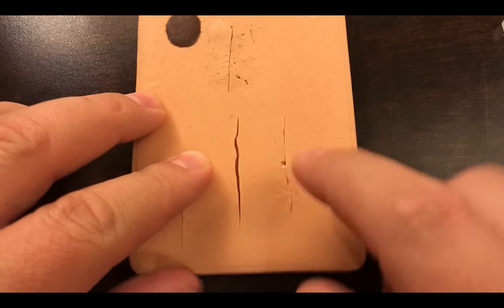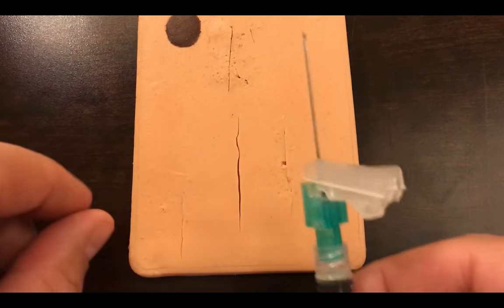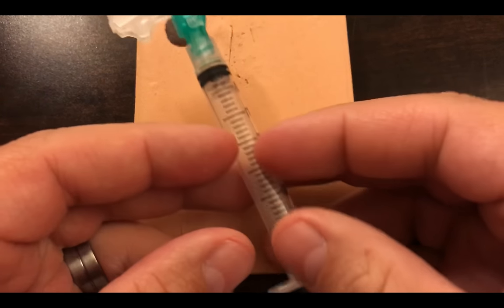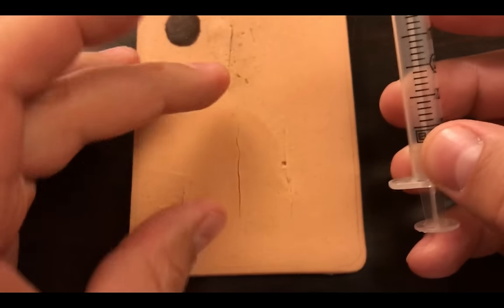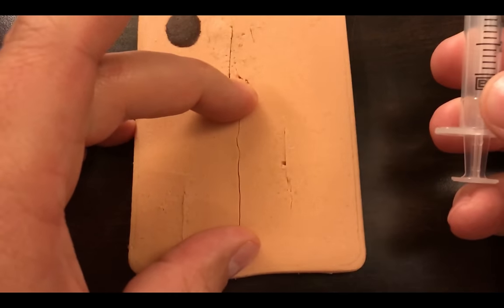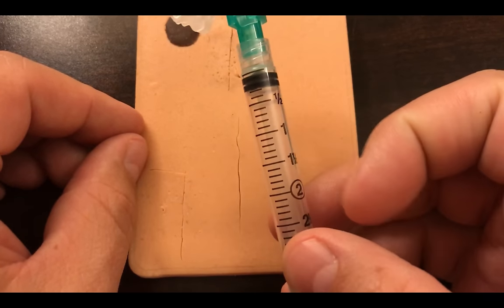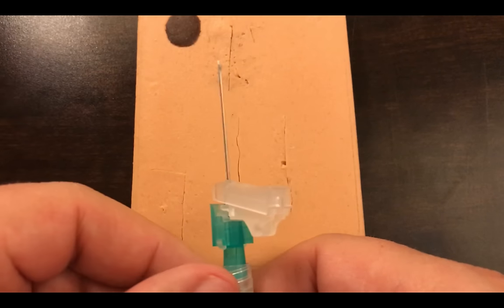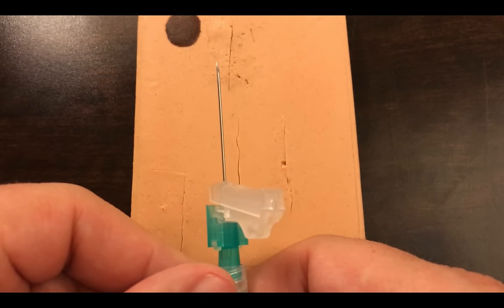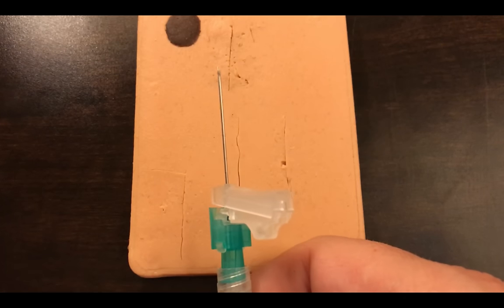For this video I'm going to use this middle laceration here to demonstrate, using this needle. This syringe is only a 3cc syringe — normally I'd use something like a 6cc and draw up maybe 5cc of lidocaine depending on the length of the laceration. The needle you generally want to use is something like a 25, 27, or 30 gauge — a high gauge, meaning small needle — and generally an inch and a half to two inches long.